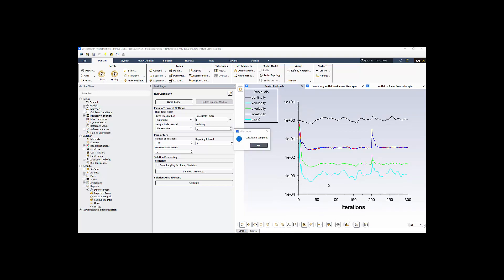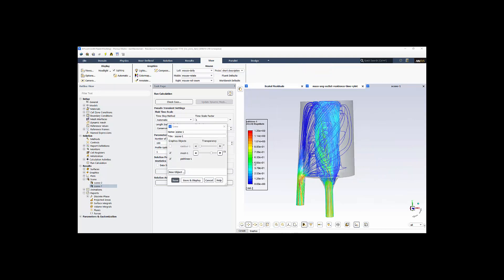When we finish, we run out the number of iterations prescribed. It says calculation complete. We say OK. These are streamlines released from the inlet, flowing up through the middle section, through the filter, and then back out through the outlet, colored by speed. It's a nice way to look at it.